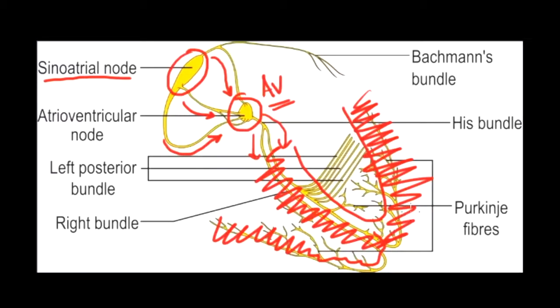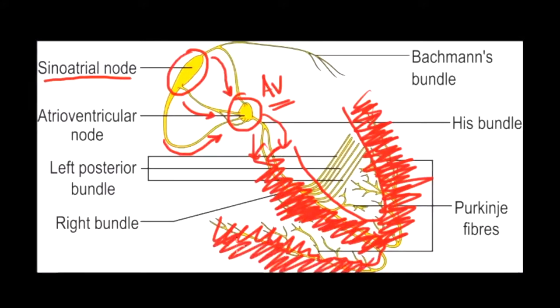What is it that we're actually measuring? What we're measuring is the depolarization of the muscle. The depolarization of the muscle is very large in amplitude, and that is what we are picking up on the EKG. Kind of like if we are demolishing a building, what do we see on the video? Do we actually see the electricity going into the wires to the dynamite? No, we're actually seeing the dynamite blow up and the building coming down. That's, in other words, what we're seeing on the EKG.